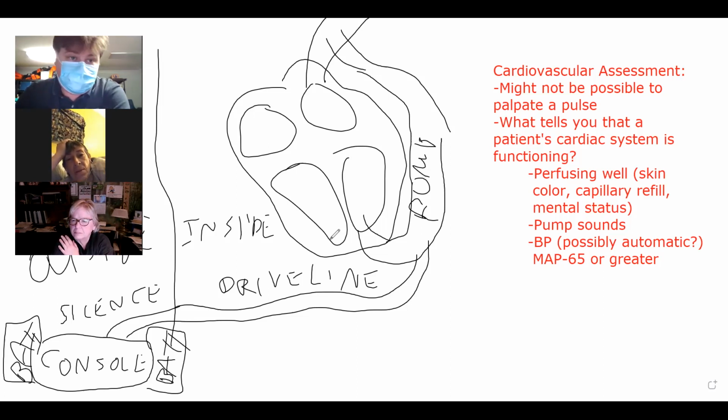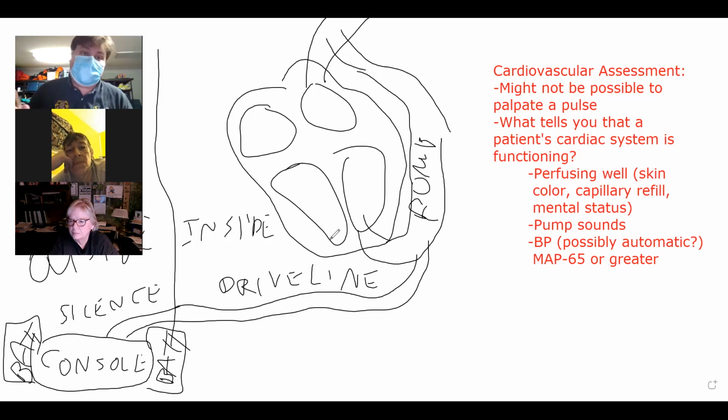The last thing that I think is really important for us to cover in VAD education, as far as the different types of problems that you might see, is CPR. Because I think the big polarizing point for these ventricular assist devices is CPR. And there are certain situations in which you really should not be doing CPR. And there are situations where you obviously want to try whatever the least invasive method is to manage the patient before you start CPR. For example, the batteries, right?